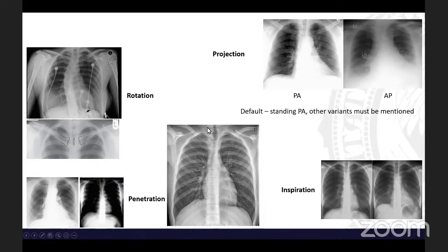So you should see the spine, and you should also see lung markings behind the heart and diaphragm. You see the vessels here. This is an underexposed picture. You see that it's too white. You can't see anything in the lung or the mediastinum, and this is overexposed. This is underexposed. Oh, bad exposition anyway. I always mix that. This is a nice picture. You should see stuff in the mediastinum.